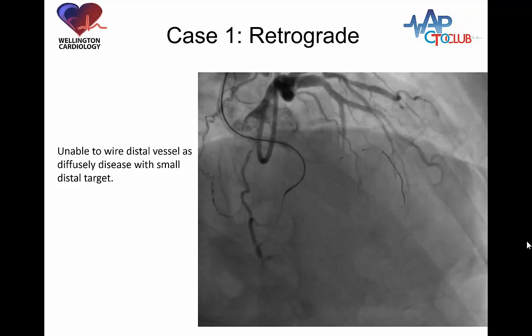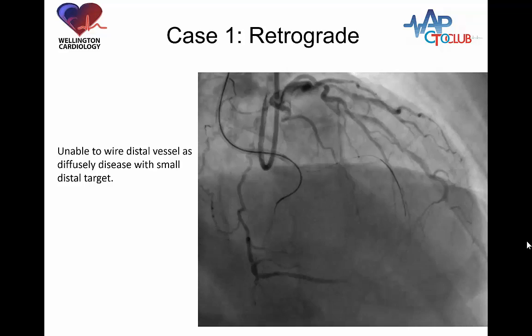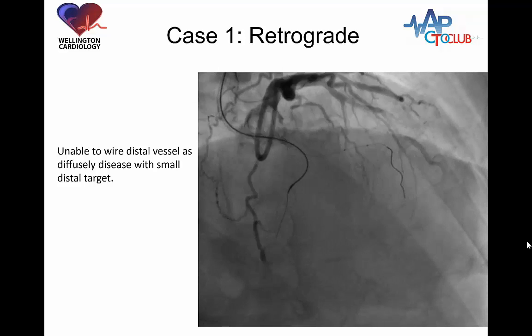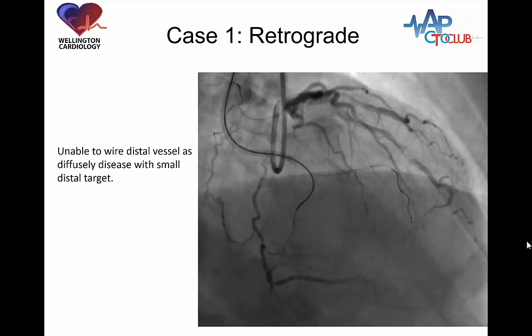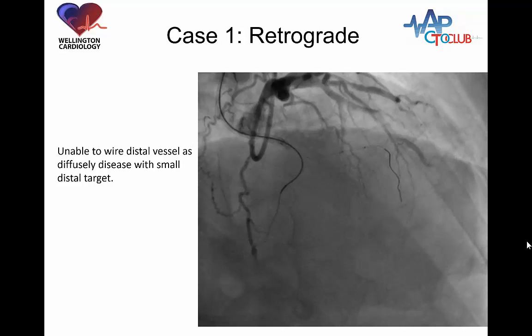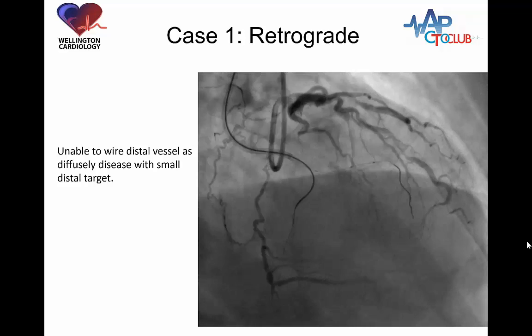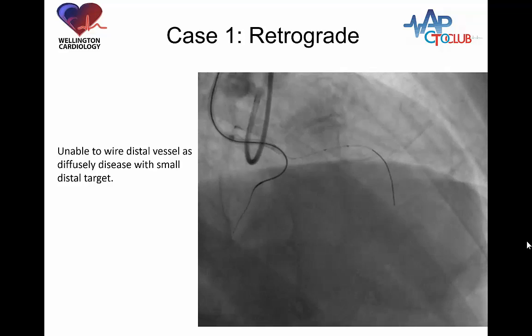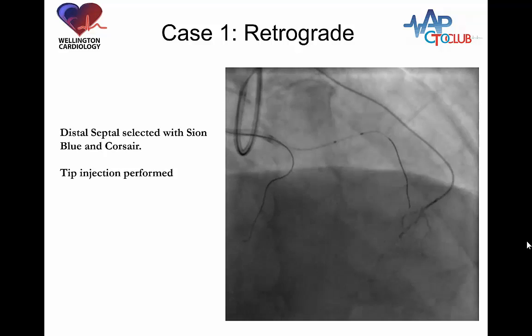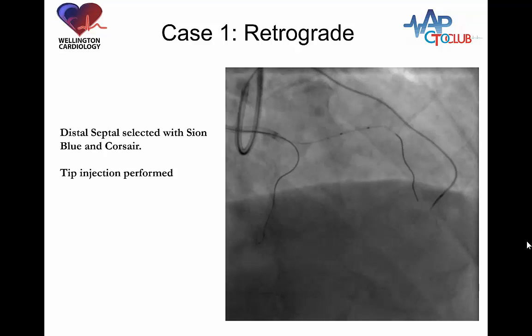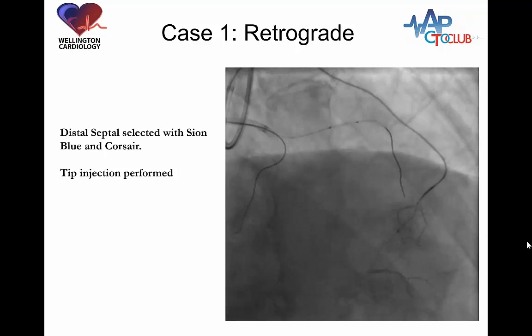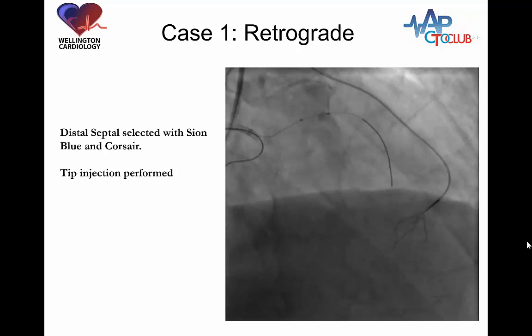From the angiogram, the dominant collateral is actually an atrial connection from the circumflex to the PLV, but this is very tortuous and not terribly attractive. There are some septal collaterals, and the most promising appears to be coming off the distal LAD. We made an attempt to wire this which was unsuccessful, so we took a tip injection, which shows a complex arrangement at the trifurcation and quite marked angulation of the septal connections.